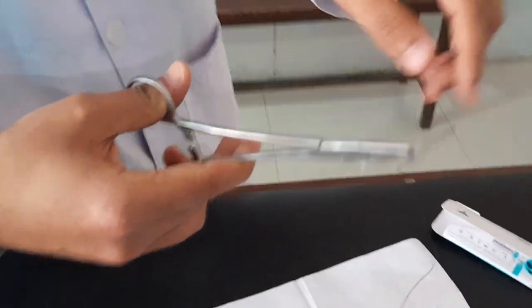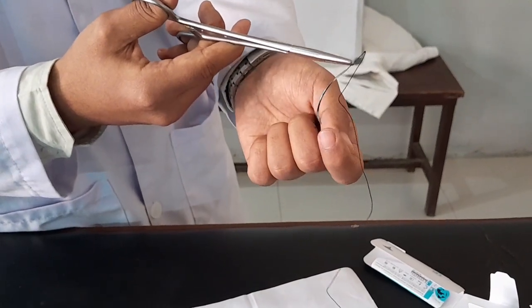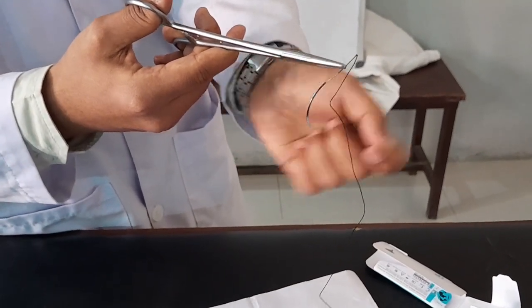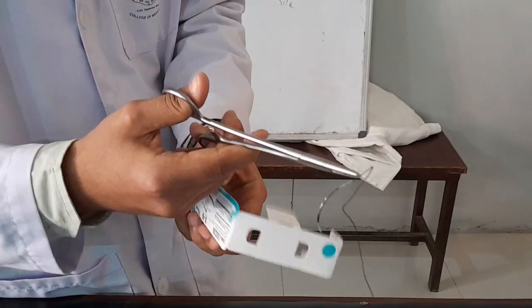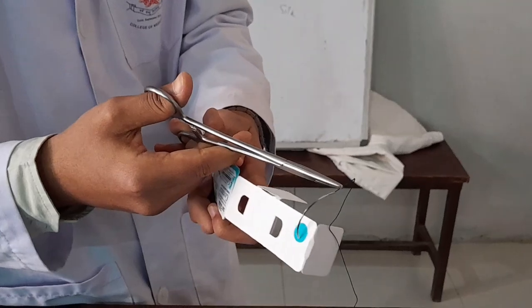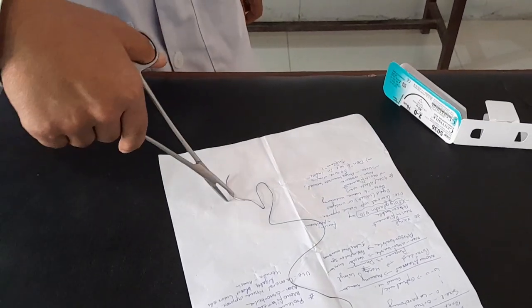Another way you can do it is to catch it on the base. Suppose, mistakenly, it goes, then it will move on its own, so there will not be trauma, because I am holding it on the base, so it will be flexible. And suppose this is my finger, then it will move. So this is another way to hold the needle and transfer it. This is where to hold and how to transfer it.